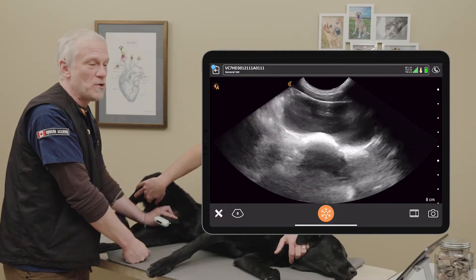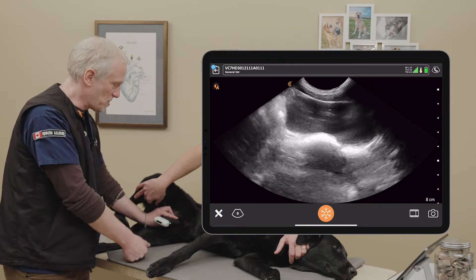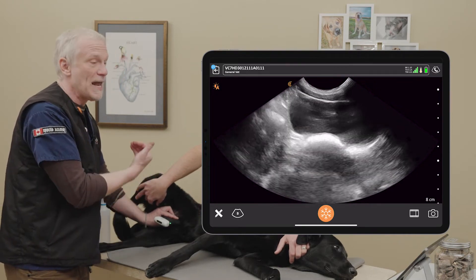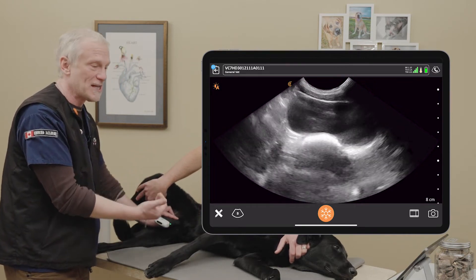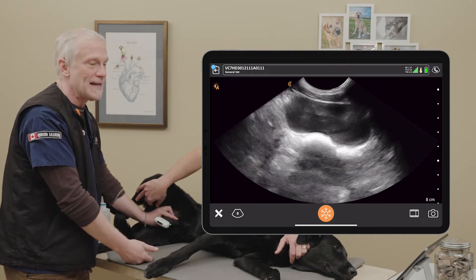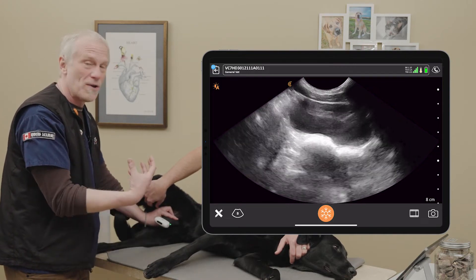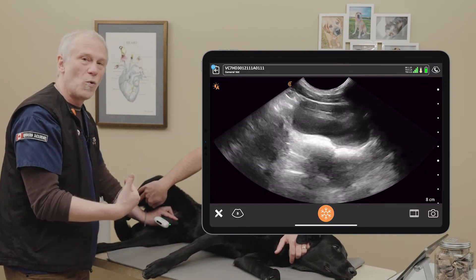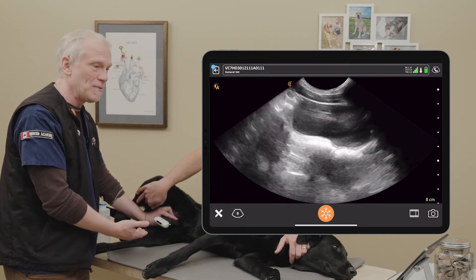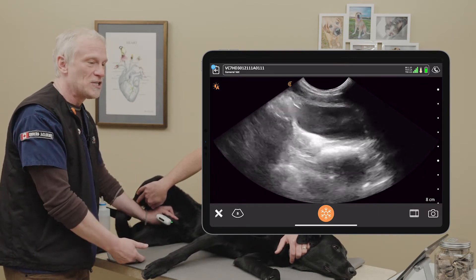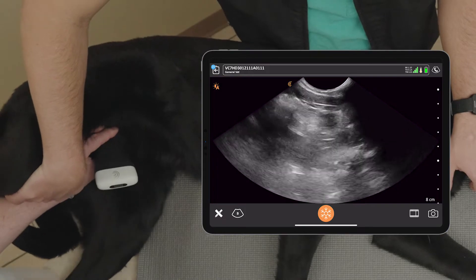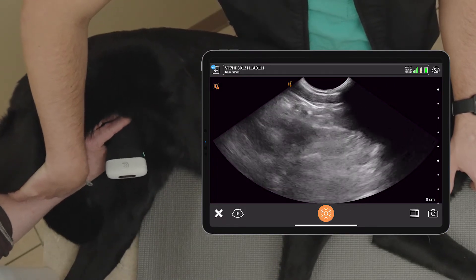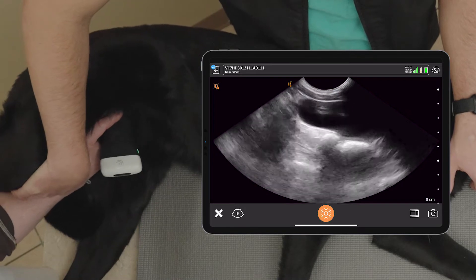Now, when we're doing this, think about patient position. If our patient was standing, I would come in straight on midline and pick up my urinary bladder. If my patient's in lateral, as we have with Penny here, then I want to think about where that pathology is going to accumulate and make sure I angle the probe down towards where that fluid accumulates, just like we did at the umbilical site. So I'm going to angle this down towards the body wall so I pick up that gravity-dependent region in proximity and around that urinary bladder.